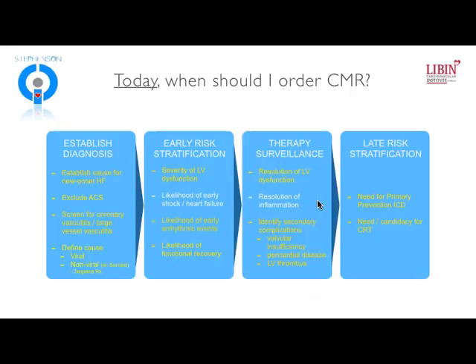And I think that also in patients with suspected ACS that go on to have normal coronary imaging, confirming the diagnosis of acute myocarditis with MRI not only has the value of providing a confirmation, but also providing some prognostic information. I do think that being able to identify other potential causes, such as sarcoid, and sometimes we see Churg-Strauss, that is amenable to high-dose steroid therapy, is something worth considering in patients that present with acute myocarditis, because we do see a subset of those patients that have very characteristic findings.